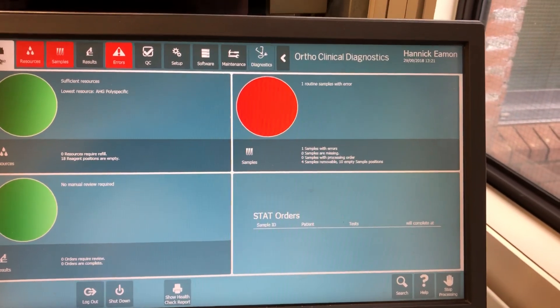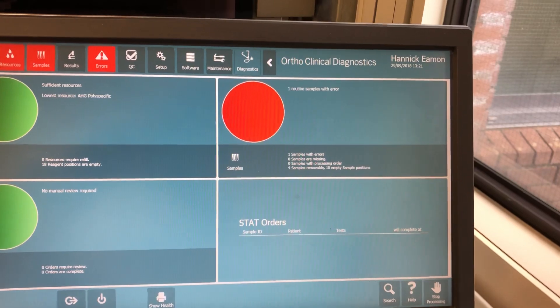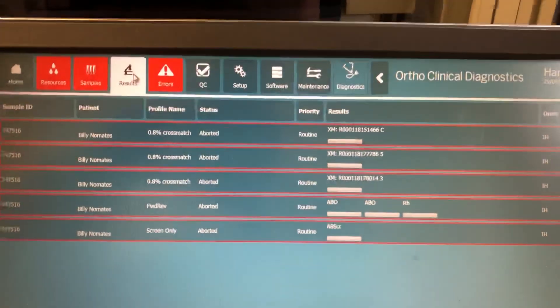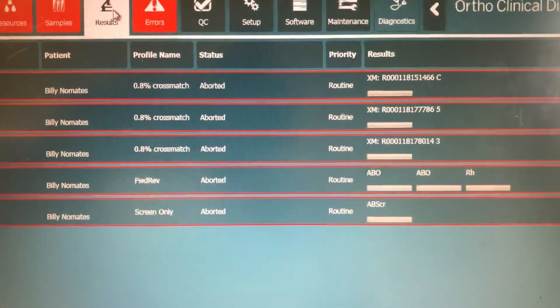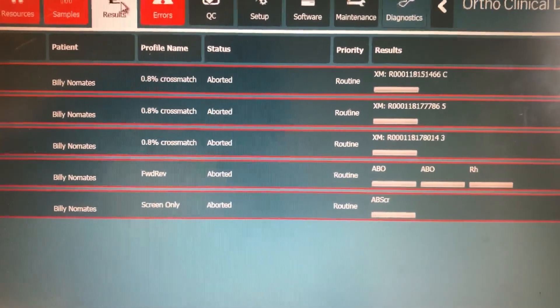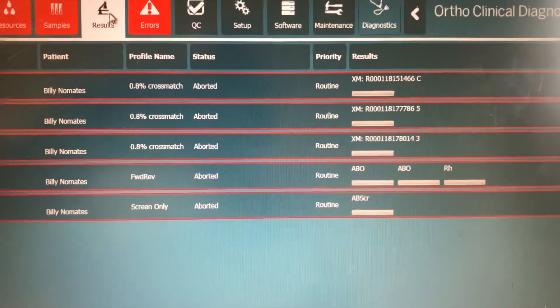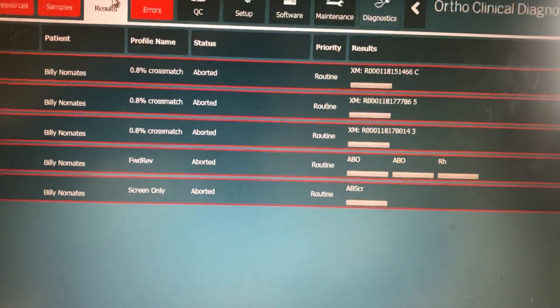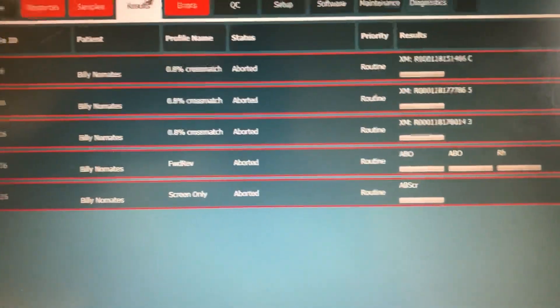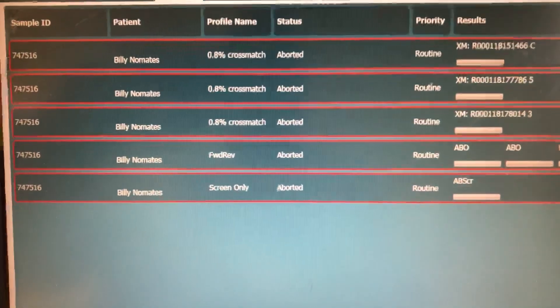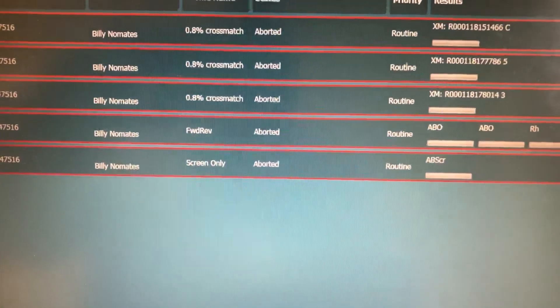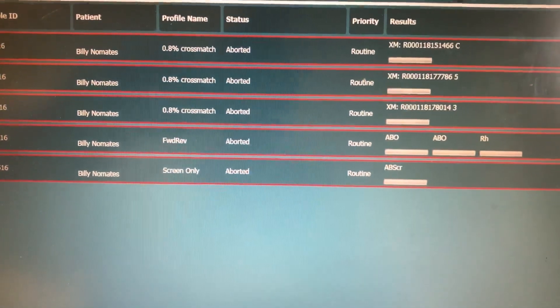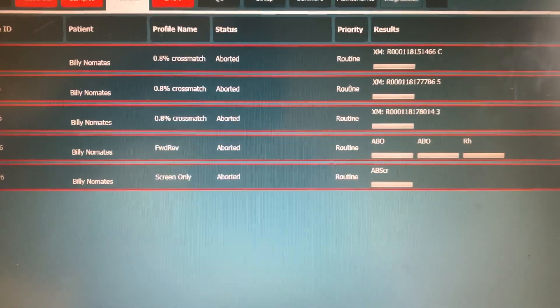Now in this particular example you see here that the cross match request, the forward and reverse, and the screen only tests have all been aborted. In the circumstances, the main reasons that this happened is if the sample is overfilled, if it's under filled, or if there's clots in the sample, or that the vision may also have crashed after sampling.